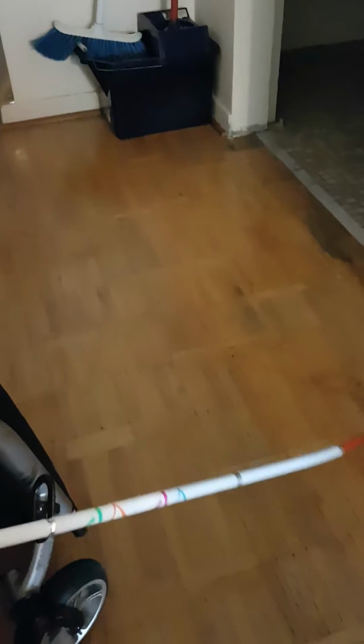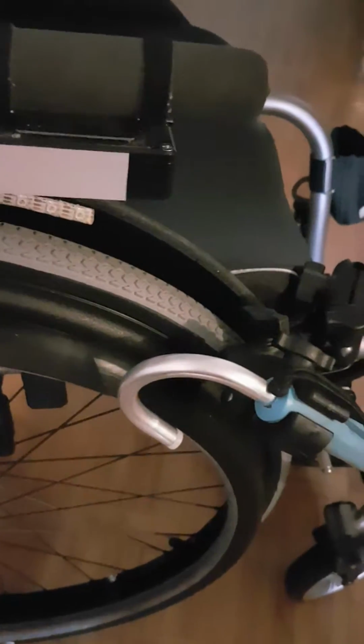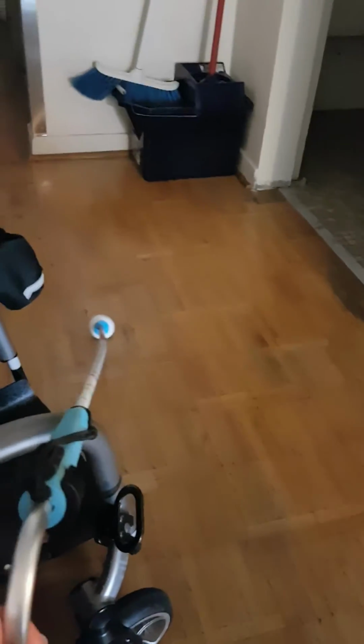Okay, now the crook handle, I got that because, well, there's two reasons actually. One, the crook stops the cane from going too far to the right, because you want it to go out a little bit from the chair but not too far. So it hits against my push rim and stops it from going too far. Also, when I'm pushing, I hit that crook, and as I'm pushing, I'm also pushing the cane. And then I just have to yank on the crook to bring it back for my next push, and then push again. So that's why I have the crook handle.